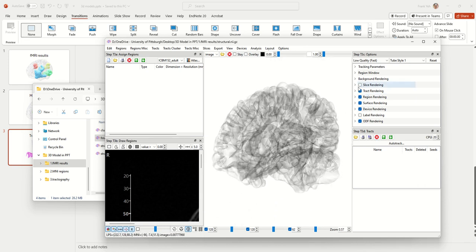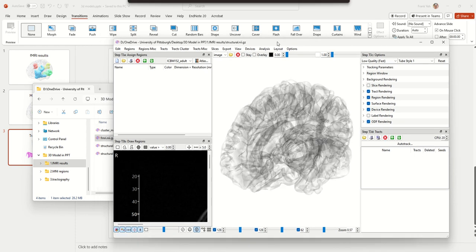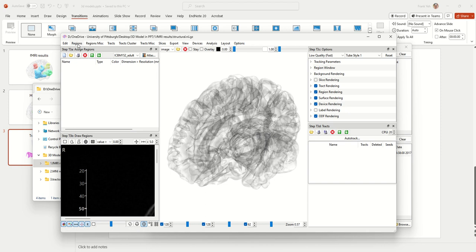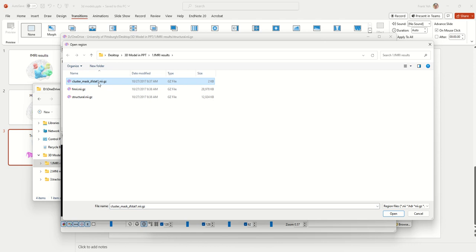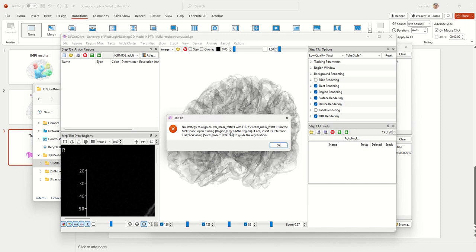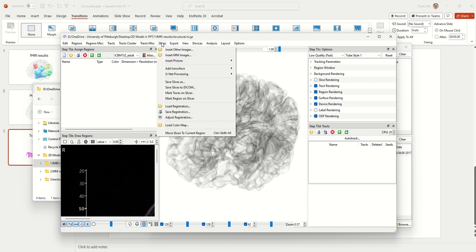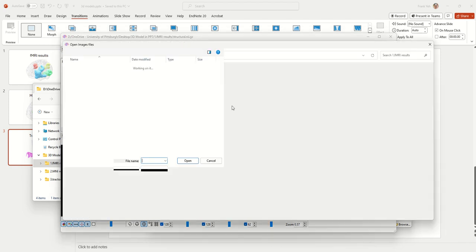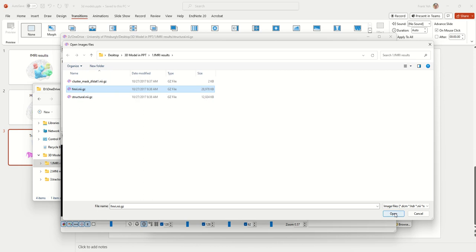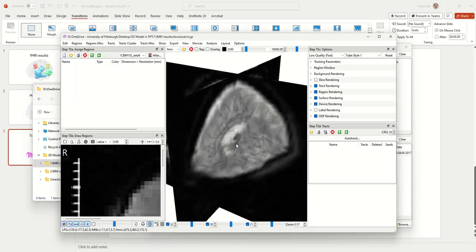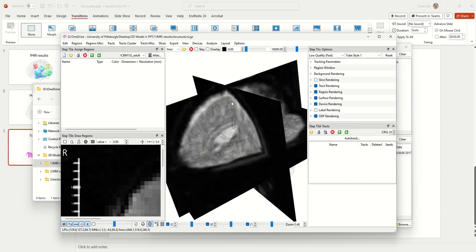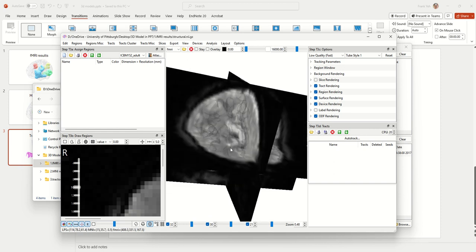Now we'd like to load the regions. Go to the Regions menu and open the region file. Because the results are in the native space, which is different from the T1 space, DSS Studio will say it's not able to load it because there is no registration available. To work this out, you first need to load the raw functional MRI data as a reference so DSS Studio can register them. Go to the Slices menu and click Insert Other Images, then open the functional MRI data. Once you open it, DSS Studio registers it with the T1, and by looking at the brain contour ISO surface you can see the alignment is good.